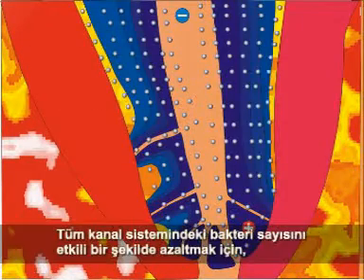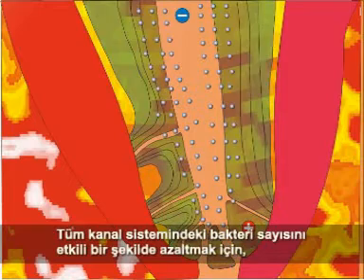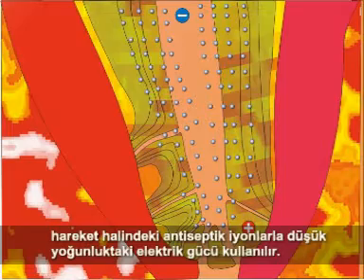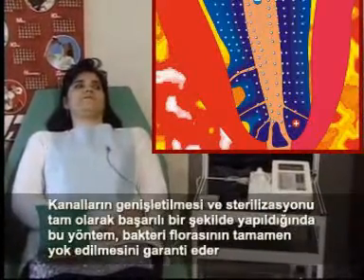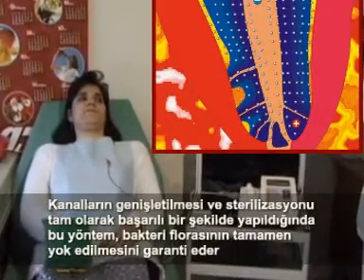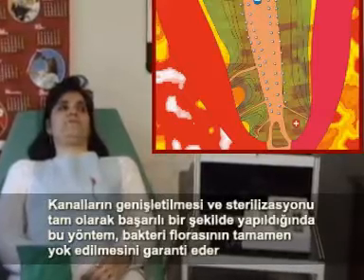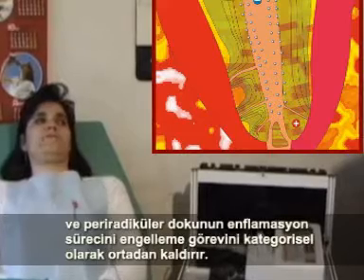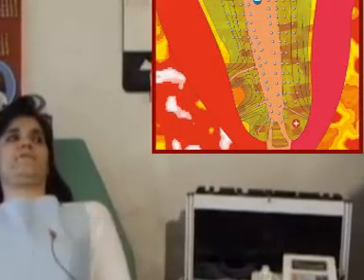To effectively reduce the number of bacteria in the whole endodont, the effect of moving antiseptic ions with the help of the electric power of a strictly dosed intensity electric field can be used. Based on well-performed preliminary preparation and canal cleaning, such infiltration guarantees total reduction of the bacterial flora and categorically relieves the task of the periradicular tissue for overcoming the inflammatory process.